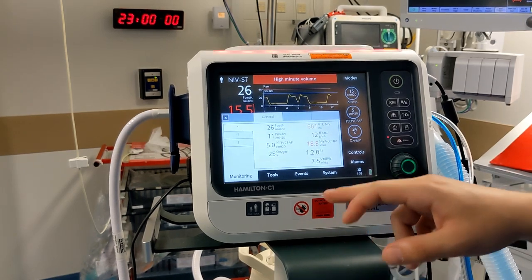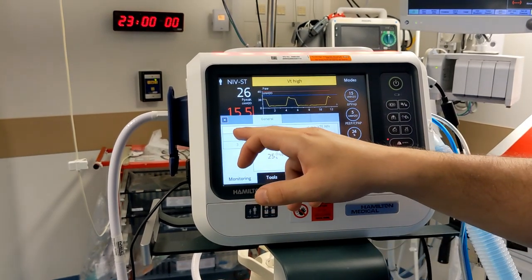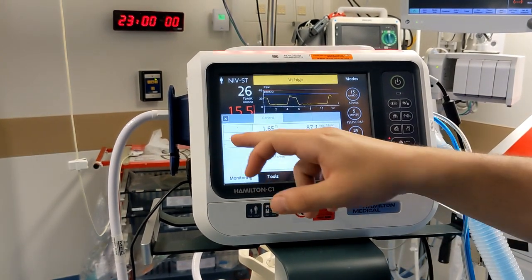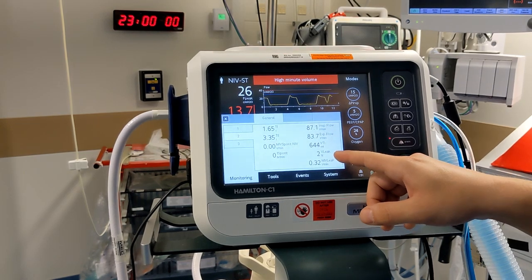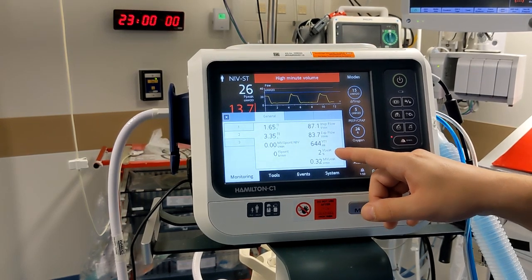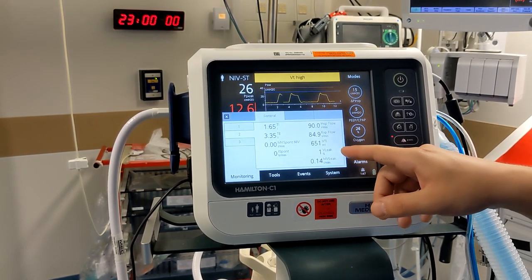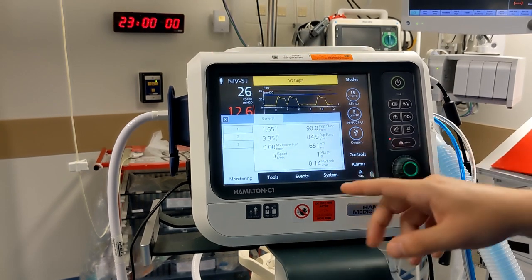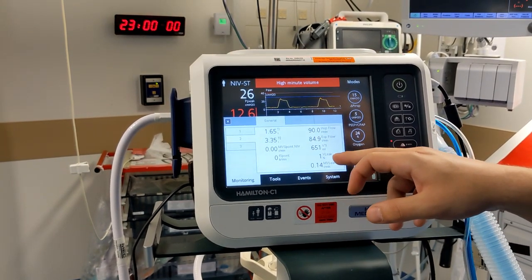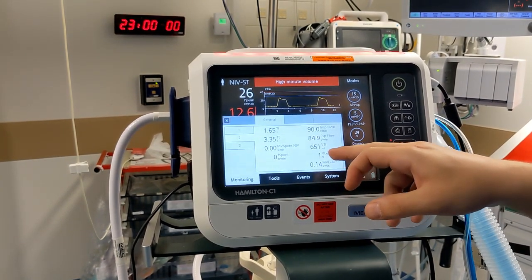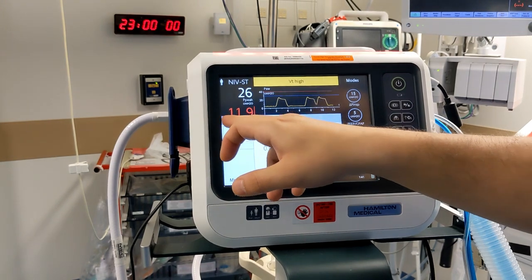It is quite helpful to go to tab 2 and look at the patient leak. This shows the percentage of leak. Anything less than 20% on an actual patient we are happy with, because a higher leak may actually affect the ventilation and the tidal volumes you are achieving.